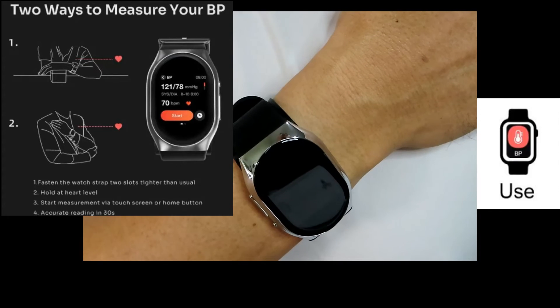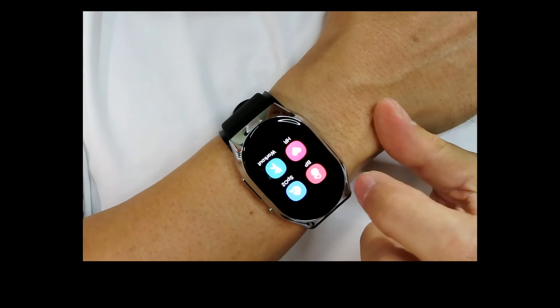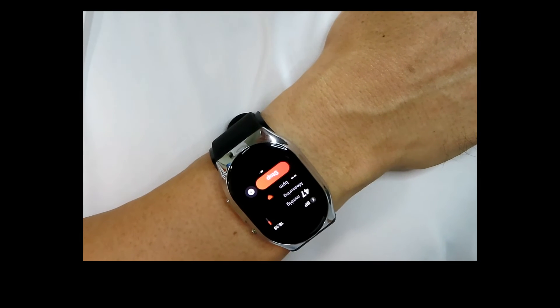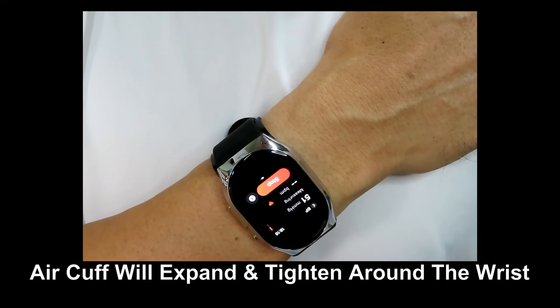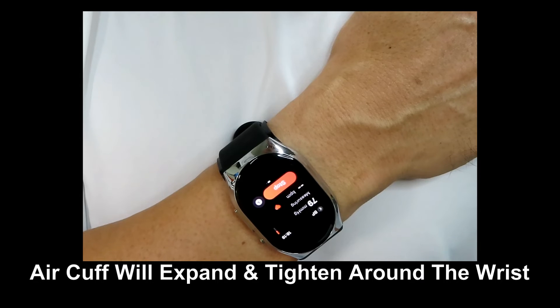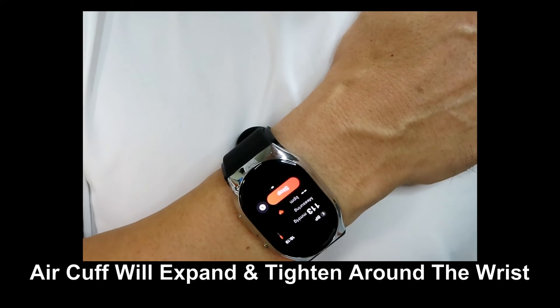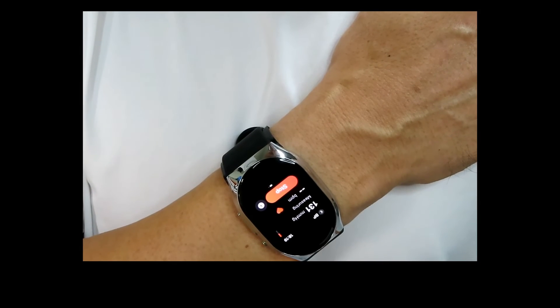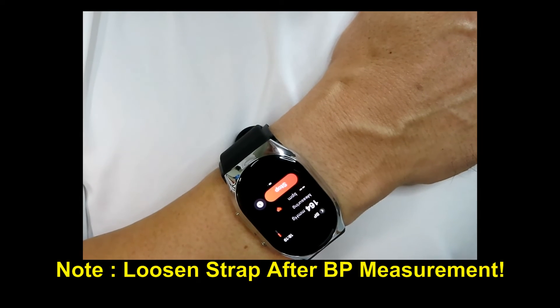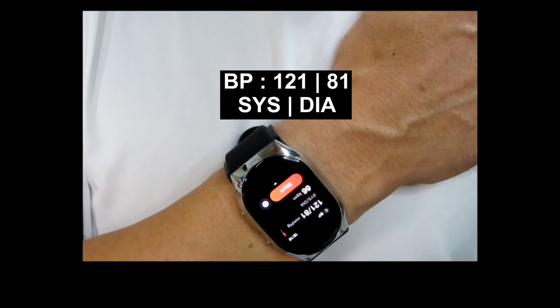We're going to take our blood pressure and hold still with the smartwatch close to our heart. Let's go to the menu, select blood pressure, and start. It's registering a reading of 121 over 81.